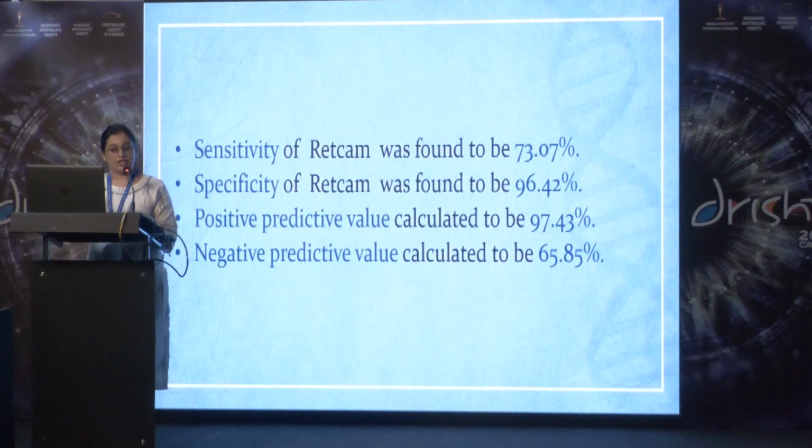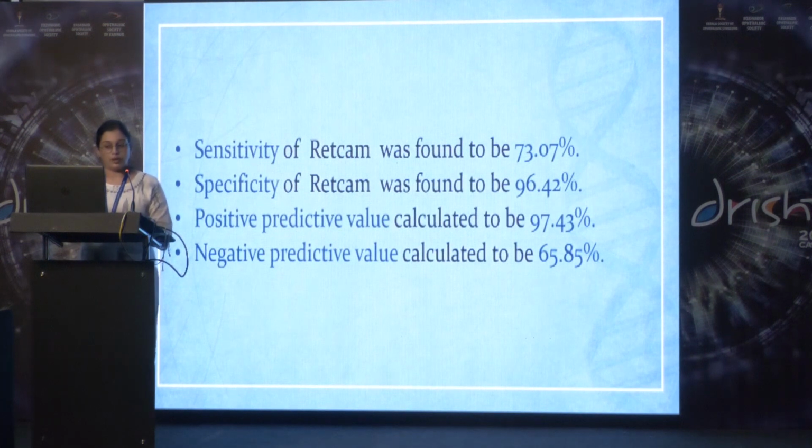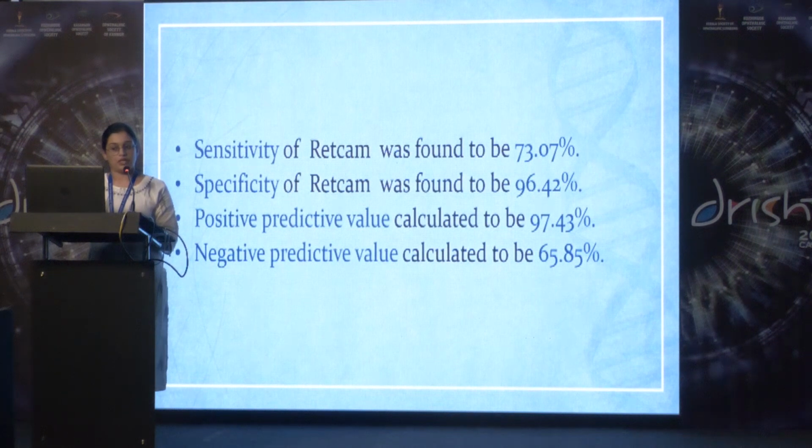From this, the sensitivity of RETCAM was found to be 73.07%, specificity was found to be 96.42%, positive predictive value was calculated to be 97.43% and negative predictive value was 65.85%.